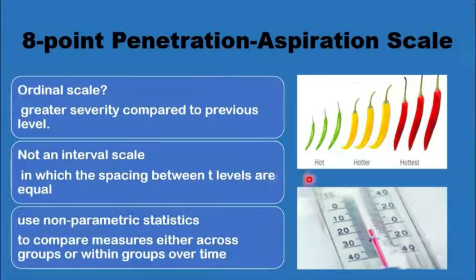The importance of it is that if we are doing any statistical manipulation for data from the videofluoroscopy penetration aspiration scale, you should be using non-parametric tests and not parametric tests, because it's at best an ordinal, not an interval scale.